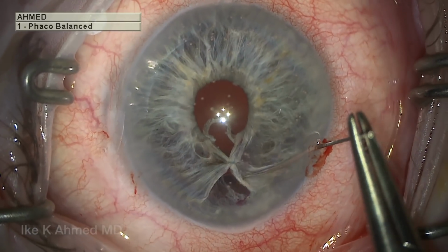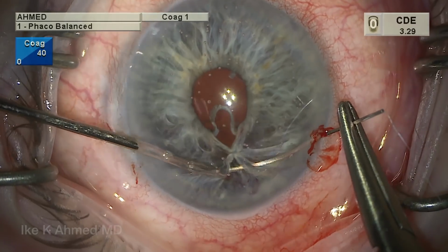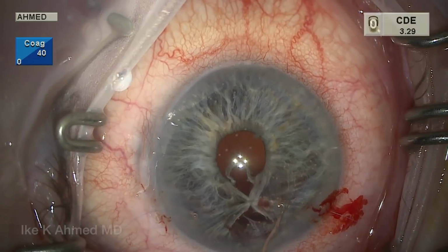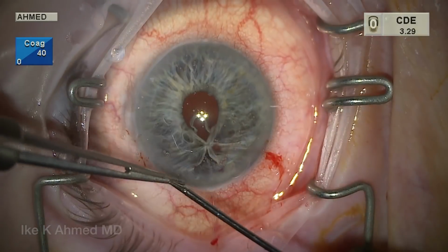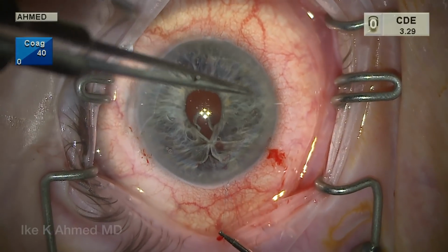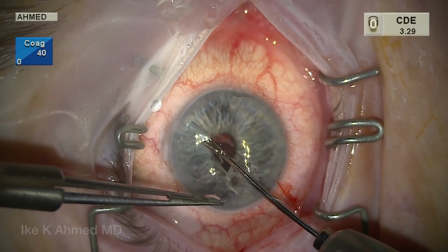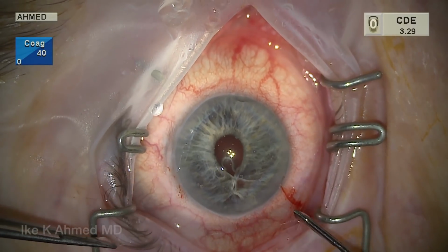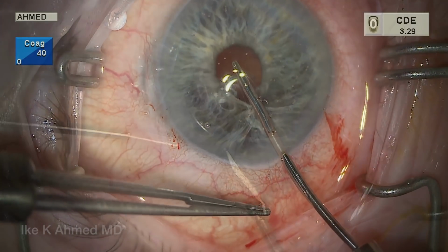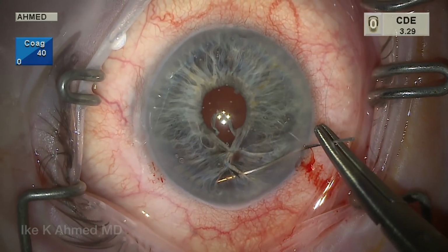We continue to then close the defect, again using this CIF4 needle on the polypropylene suture, passing it through both sides of the iris defect and then removing it from the anterior chamber. Bringing both ends of the suture out of the main incision, tying it outside, again facilitated by a regular straight tier and a micro tier to lock the knot, thereby securing the knot in place without having to move the iris tissue much and keeping things in position. Micro scissors again help to keep incisions small.